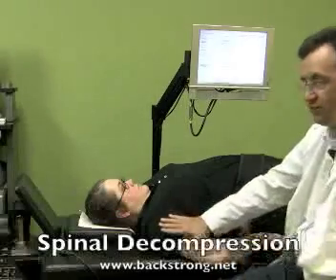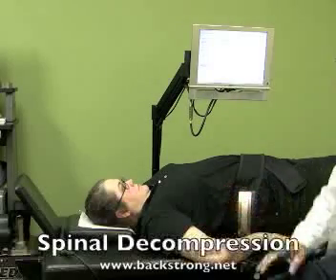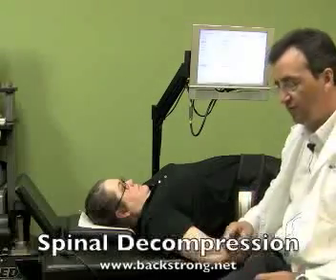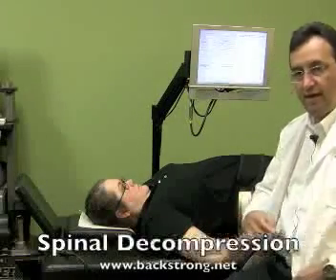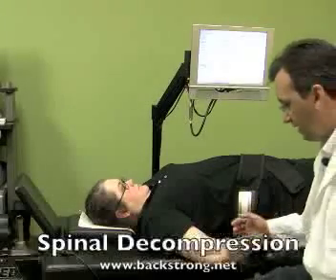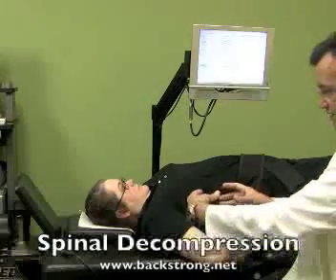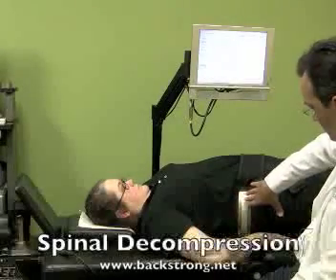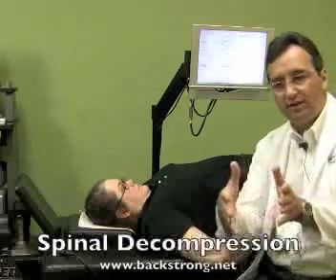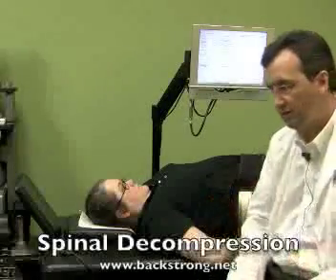First of all, we have her set up here so she's lying face up. We have this strap around the ribs so it keeps her upper body on that half of the table. We have these restraints here, which are grasping her right above the pelvis, and they are connected to the lower half of the table. This is a table that runs on a piston, and the table is going to separate like this and slowly take her pelvis in this direction, thereby decompressing or taking pressure off of the joints of the low back, the 5 lowermost discs and joints.